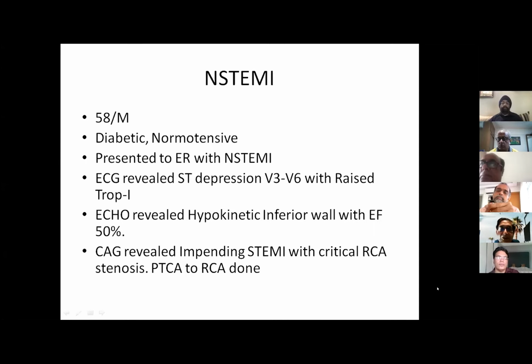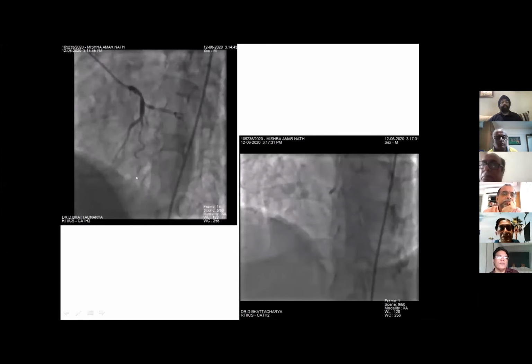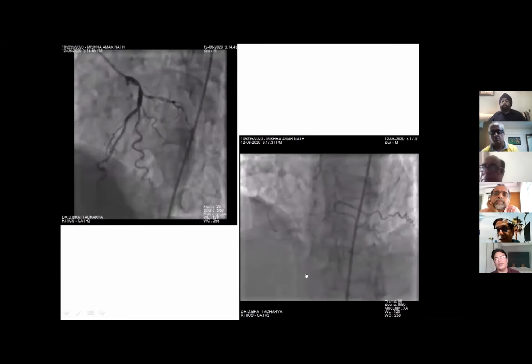And when we did the angiogram, this is what it showed. You can see that the circumflex is nothing to write home about, but in the LAD there is an ostioproximal stenosis, which is about 50 to 60% at the least. But I thought that this cannot be responsible for his symptoms. So I thought it was the RCA that was causing his trouble, and sure enough, this was the RCA. You can see that there are 3 stenoses there, one at the distal RCA, one in the PLB, and one in the PDA. And the PDA actually looks quite a smallish vessel. So we had to quickly think what to do about this.